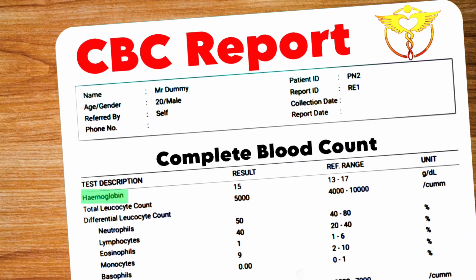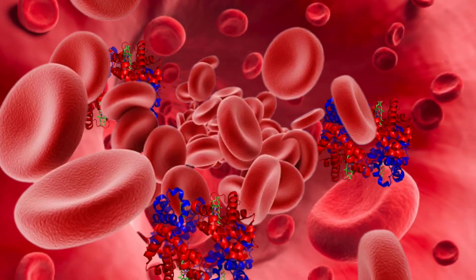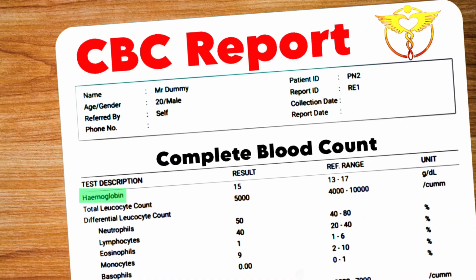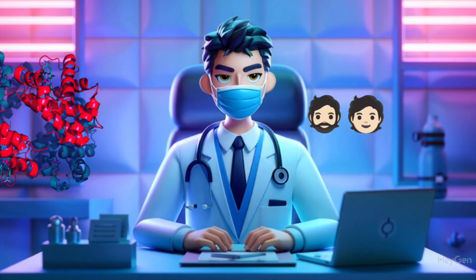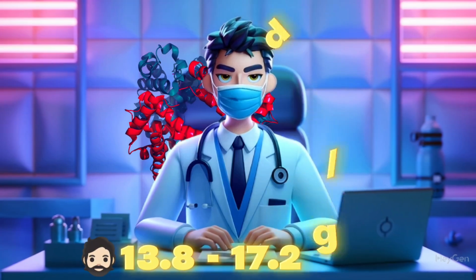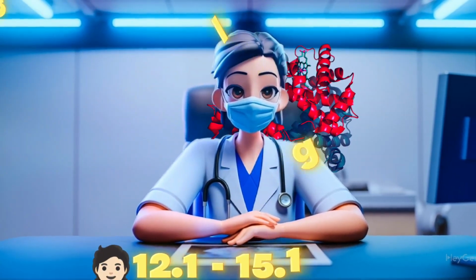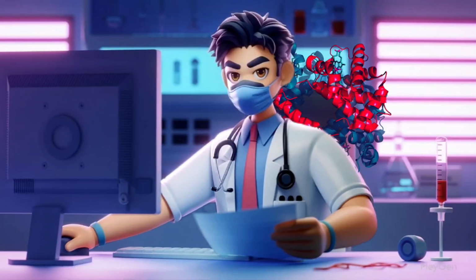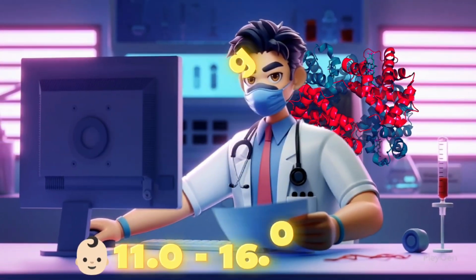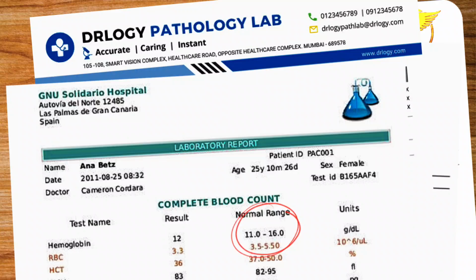Let's start with the hemoglobin, also called HB or HGB. The purpose of hemoglobin is to measure the oxygen-carrying protein in red blood cells. The normal range of hemoglobin is between 13 to 17 grams per deciliter, but it is different in men, women, and children. For men, it is between 13.8 to 17.2 grams per deciliter. For women, it is between 12.1 to 15.1 grams per deciliter. And for children, it is between 11 to 16 grams per deciliter. This range can vary from lab to lab as per the method of report study.